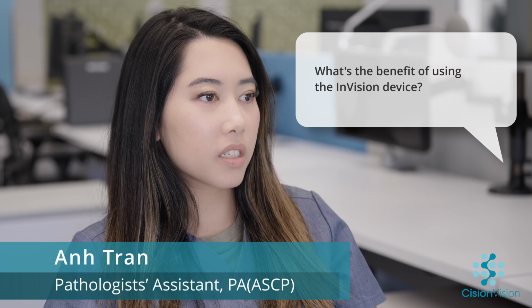So the benefits are, because the device is real time, there's no cost of time to use the device, and there's only benefit because clinically any extra lymph node can make the difference for staging and treatment. Because it's so efficient, it only serves to benefit patient care. It's absolutely worth it. There is no need to go back.